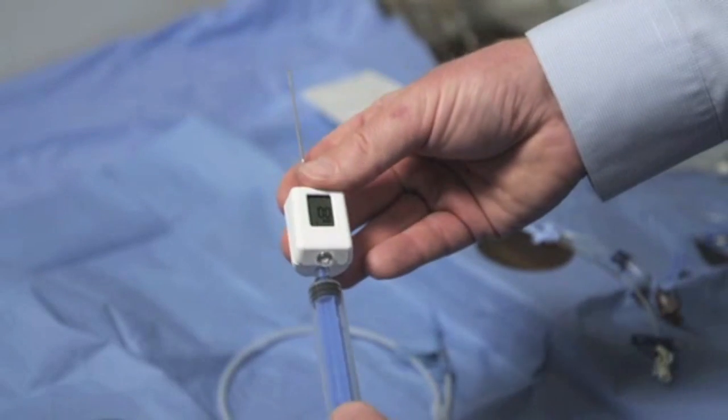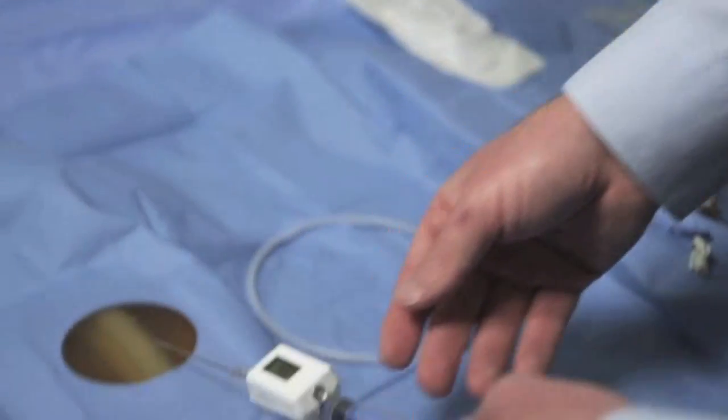Once the device is attached to the needle and syringe, you can proceed with the insertion.